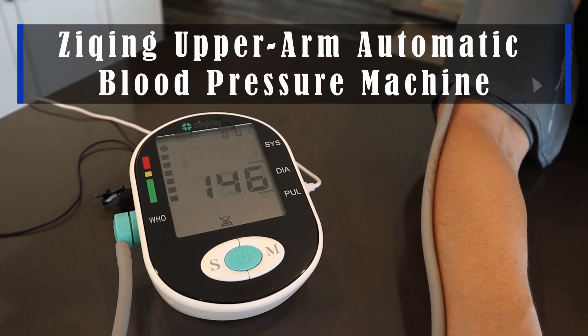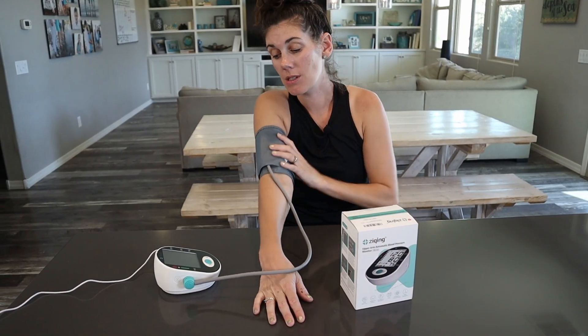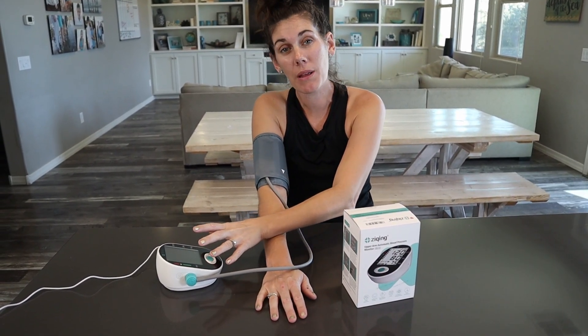Hey guys, this is the Zicking upper arm automatic blood pressure machine. It's a great device for checking your blood pressure and your pulse at home — really easy to use. You're just gonna get the cuff on your upper arm.